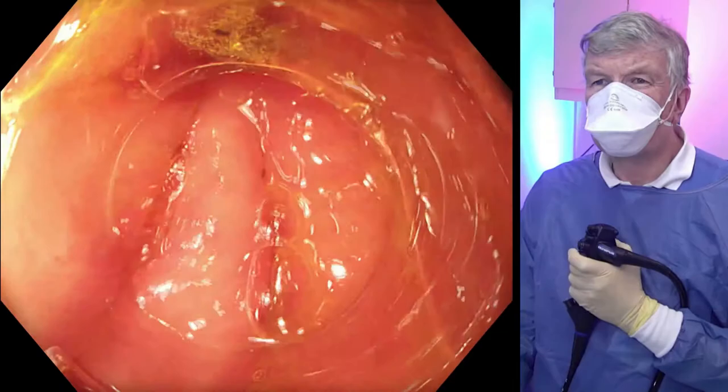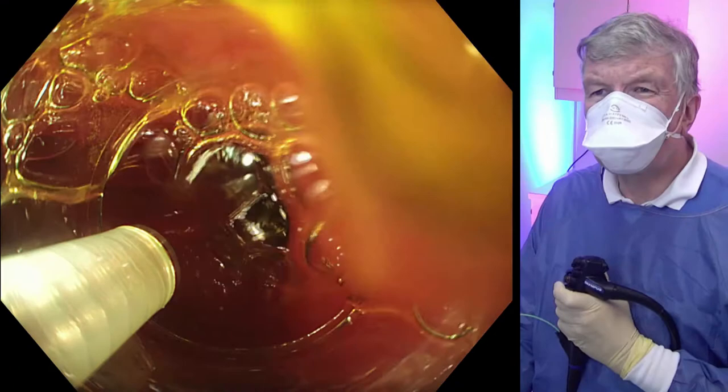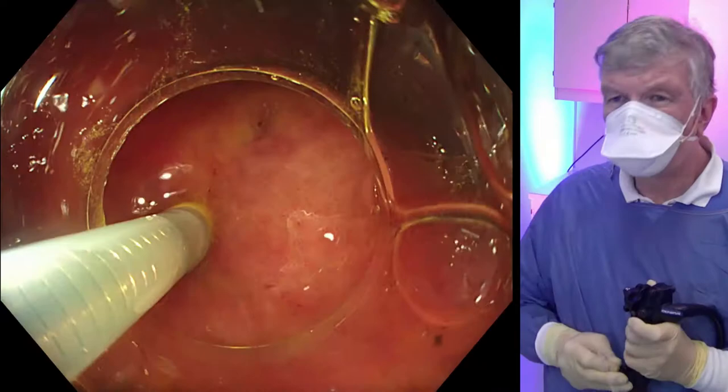Now we pull back with a conical distance cap. We see the pylorus again, and along the greater curvature we leave some four to five centimeters for the entry site and start injecting. We see the bluish bleb with the blue saline.